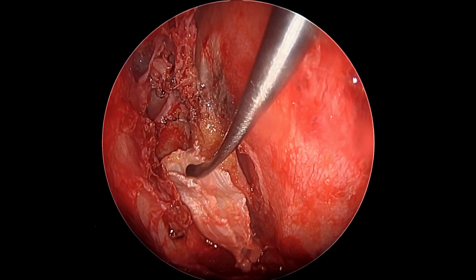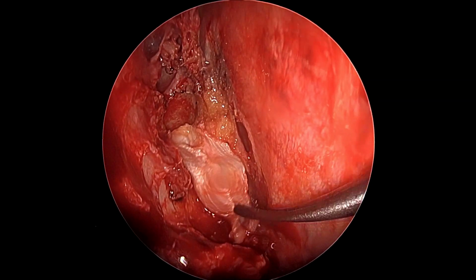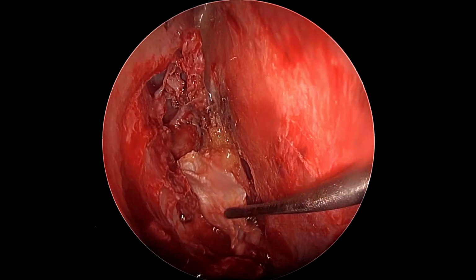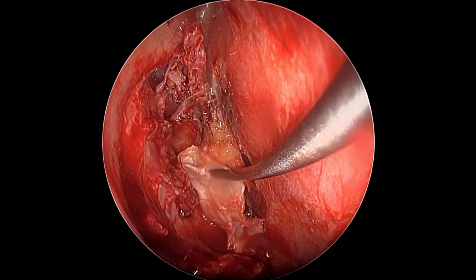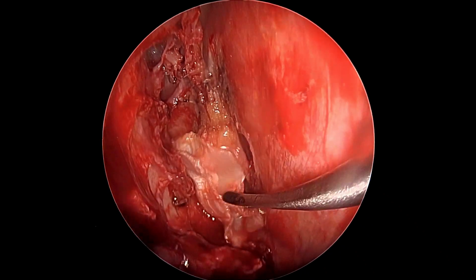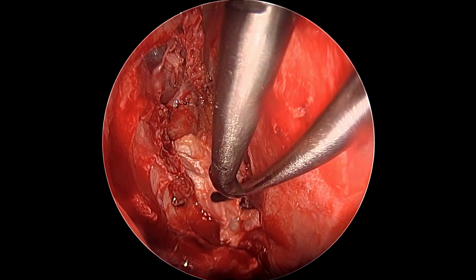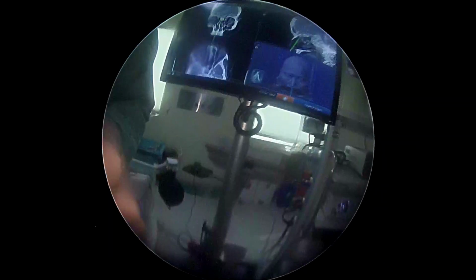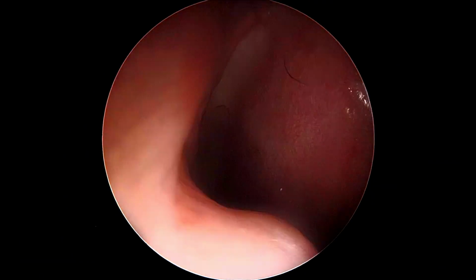Here we are using a fascia graft to cover the fat, and this fascia graft is larger, so that is why so much effort was done to clear all the bone, the septations, and remove the excess mucosa all around, and to devitalize it where you cannot remove or peel it. Now in this situation, we can use two hands to adequately spread the fascia over the fat.